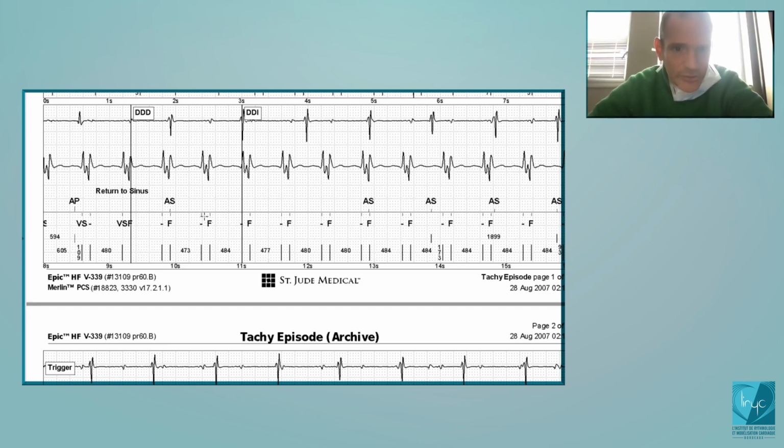But because of the way you are counting and analyzing every cycle, there was an increased risk of inappropriate therapy in case of double counting of the R wave in Abbott devices, because there is a latency before the return to sinus rhythm. You understand? This is the only company where this problem could end with an inappropriate therapy.